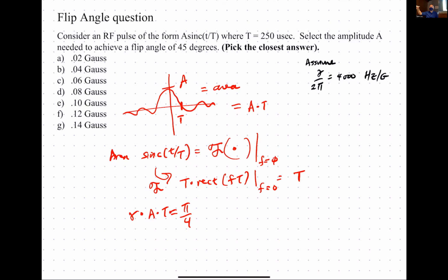That turns out to be very important for imaging, because in MRI we acquire data in the Fourier domain. So the center of k-space is essentially the average of your object. That's why that value tends to be very bright, because most objects we look at have non-zero area. Any other questions? That's a good question.